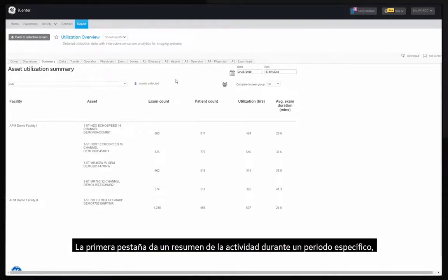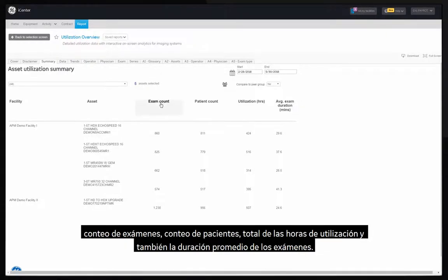The first tab provides an overview of activity over the selected period, exam count, patient count, total utilization hours, as well as average exam duration.